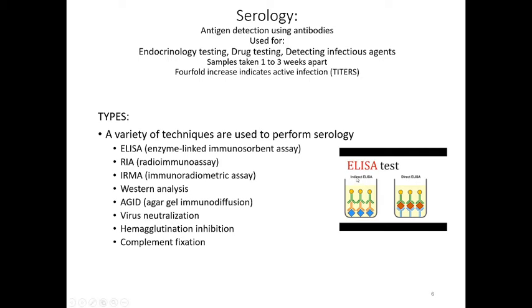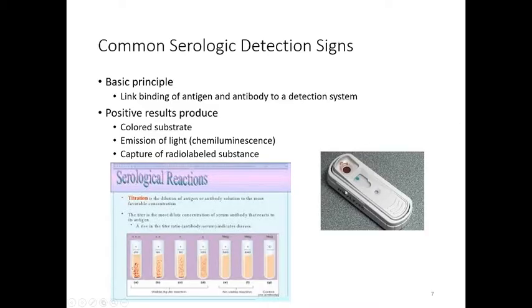Basically what this is doing is it's taking the sample, which is the blood, that has potentially the antigen for a disease in it, and then using known antibodies, so a sample of a reagent or blood that has those antibodies against that disease. The antigen and the antibody combine, and if you color the antibody and indicate that when it combines with the antigen it will change color at a certain spot on the test, that's how you get a positive result. So that's what we see with a SNAP test.